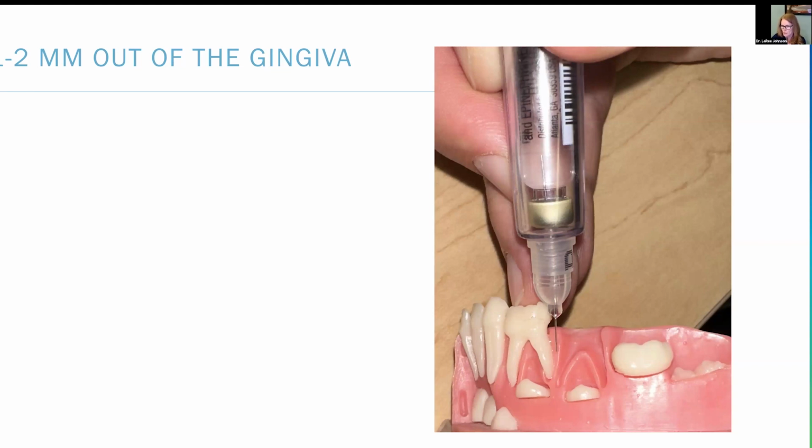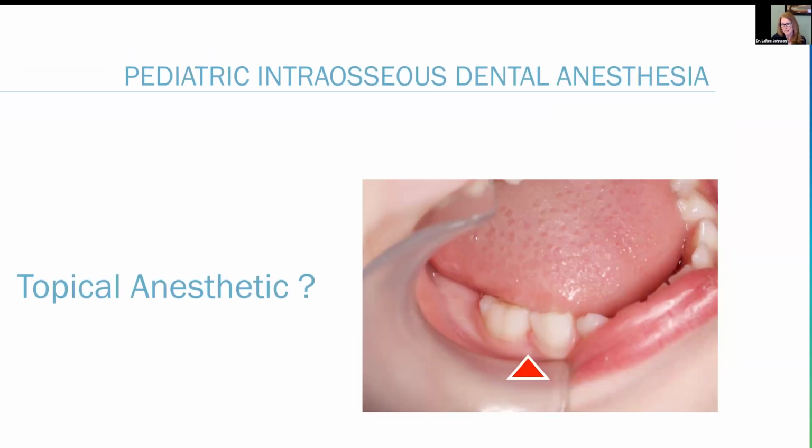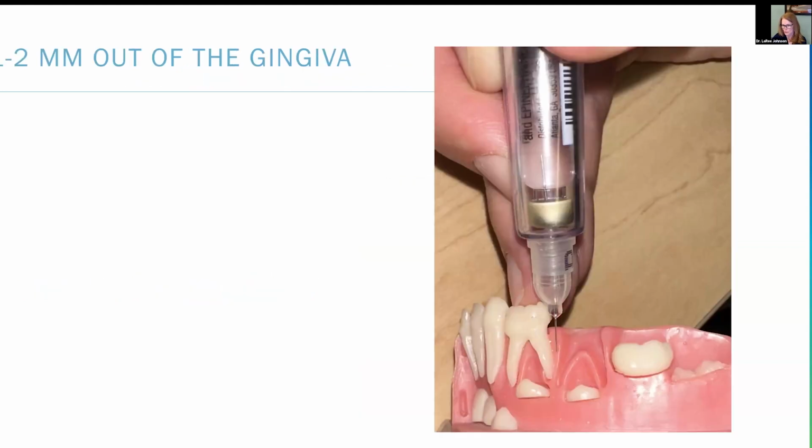This is an osteocentral injection. So what we would expect, and this is a mandibular arch, is we would expect to get 1 tooth distal. If there were 1 there, it's been extracted on this mock-up, and then 2 forward. And again, if you were removing teeth, you would want to see blanching on the lingual in this situation.